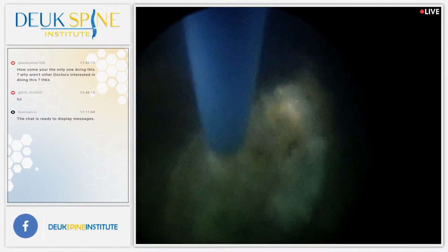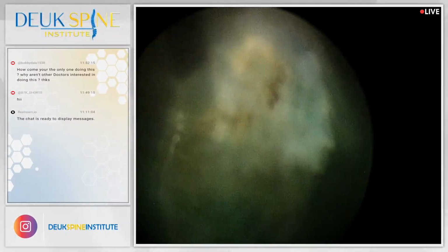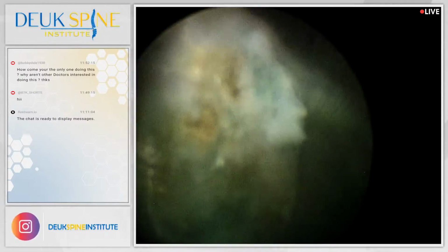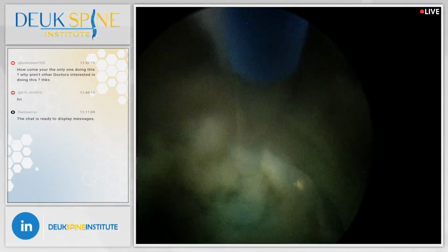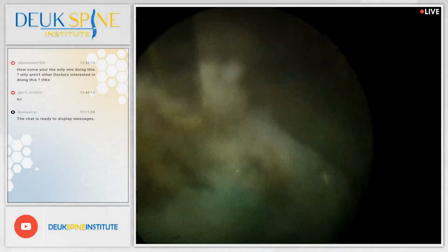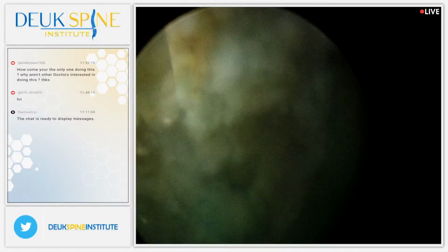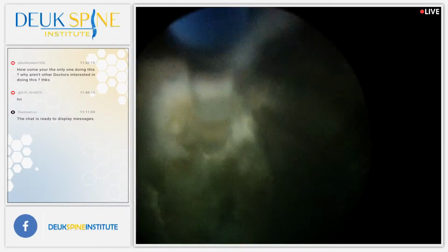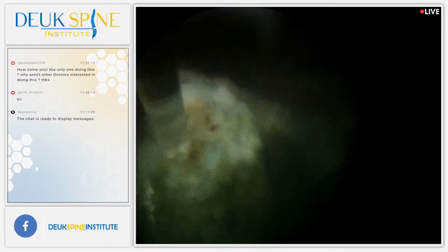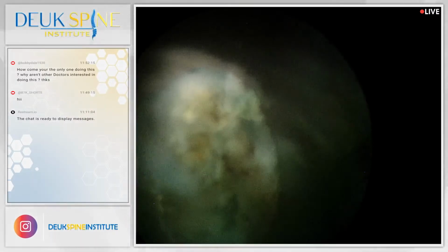So we have done now at Deuk Spine Institute 2,743 cases. This is our 43rd case. It took me probably at least 50 cases to get really good at the technique. And then it took hundreds more to really perfect it. But we've been doing this surgery now for 20 years.